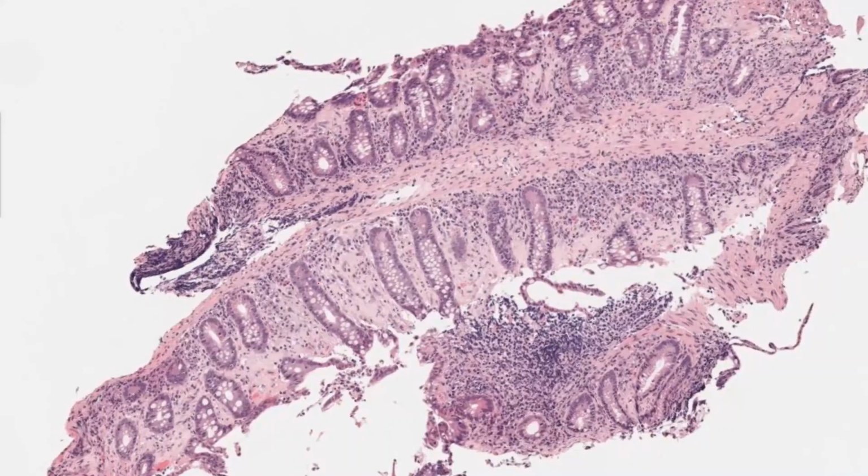It is getting heavier, which means that there is definitely an increase in chronic inflammation in the lamina propria. You can see here that this is very eosinophilic, definitely very eosinophilic here and there, and that should raise your eyebrow. With the eosinophilic lamina propria, can it be ischemia or can it be something else?